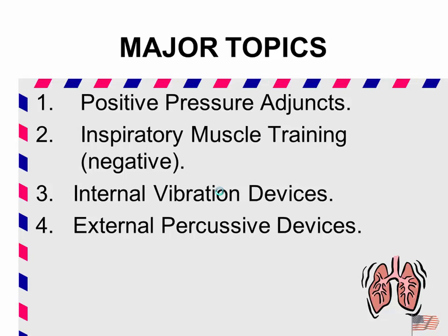talking about positive pressure adjuncts. And then we'll talk a little bit about muscle training, both inspiratory and expiratory. And then get into the internal and the external vibration devices, which are there to mobilize secretions.